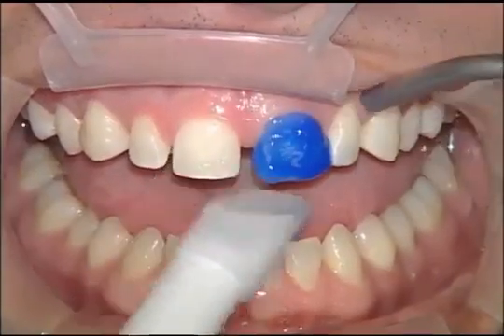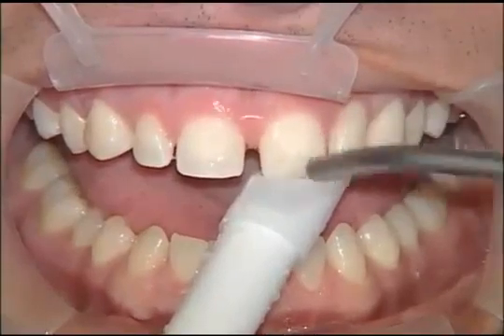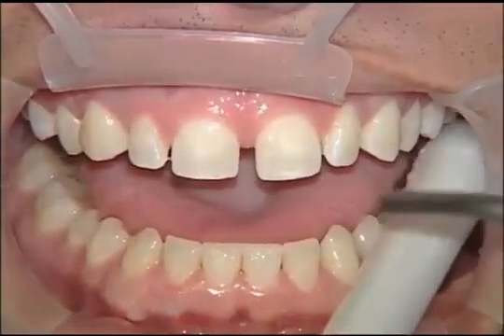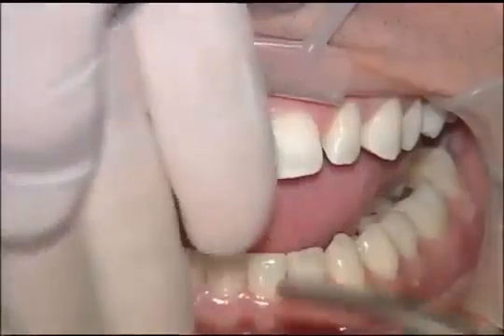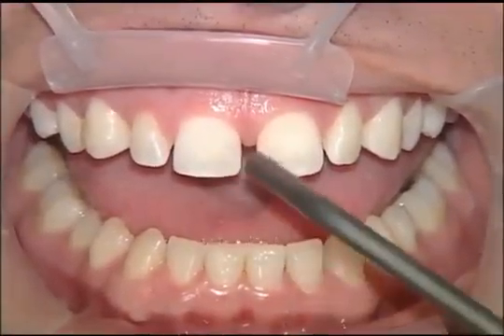We're going to go ahead and rinse off the 37% phosphoric acid. As you may have noticed, we have only etched the central incisors so far. And as we air dry this, you'll notice that we see that frosty appearance that we're used to from the old days of bonding when we were primarily etching enamel.